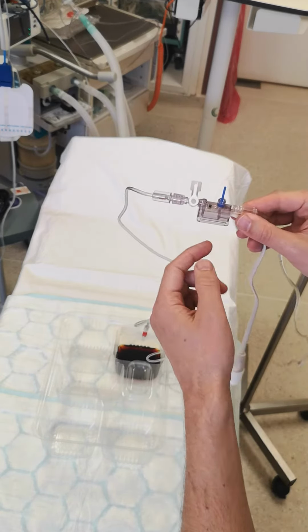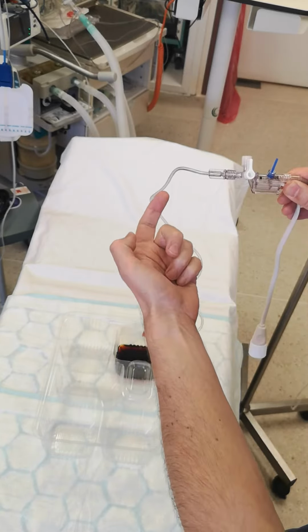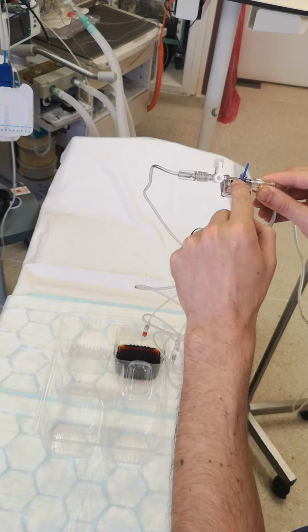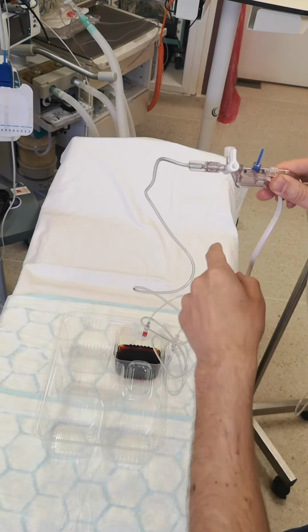So essentially, all the measuring components are in this small transducer here. The oscillations from the artery will be pushing all this column of fluid into that. A little diaphragm will measure it here and change it into an electric signal to measure at the monitor.